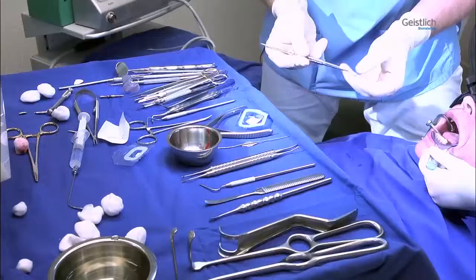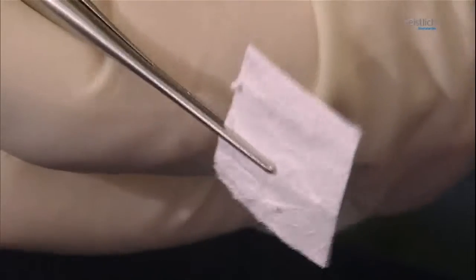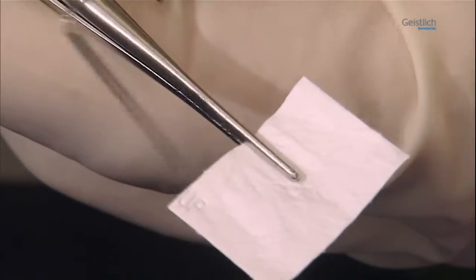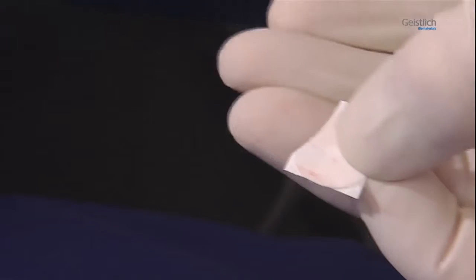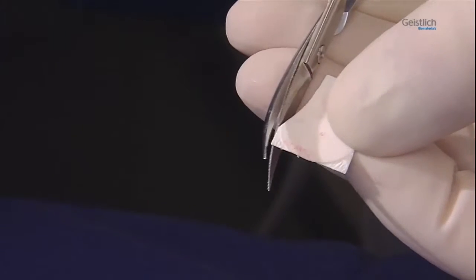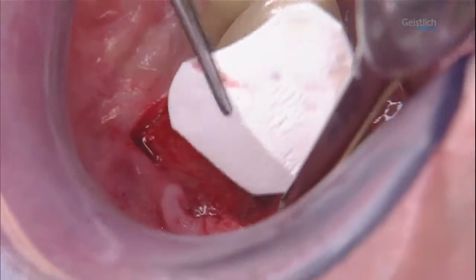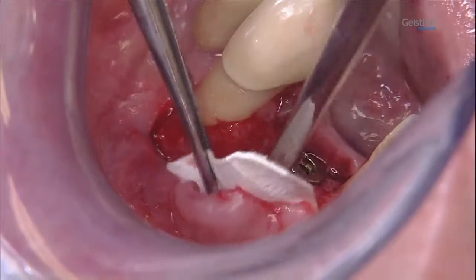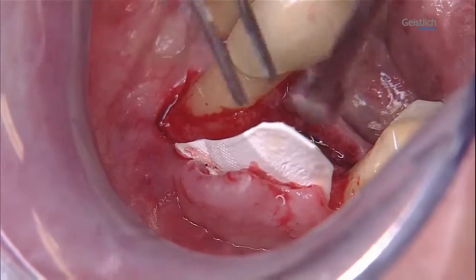The 16 x 22 mm Geistlich Bio-Gide has two differently textured sides. The outside of the membrane is marked with the embossed word UP. The shape and dimension of the template are now transferred to the membrane. The embossed UP can be clearly seen here again. Once the membrane has been cut to match the template, its broader base is first pushed under the mucoperiosteal flap. The collected autologous bone is applied in close proximity to the implant.